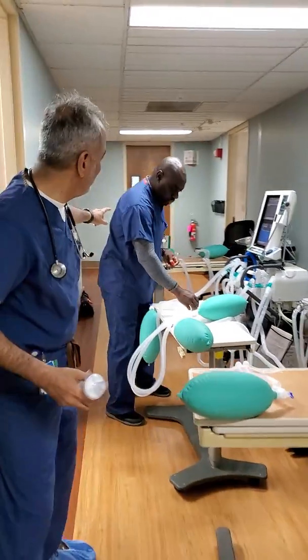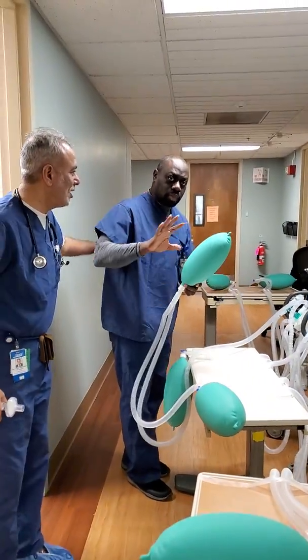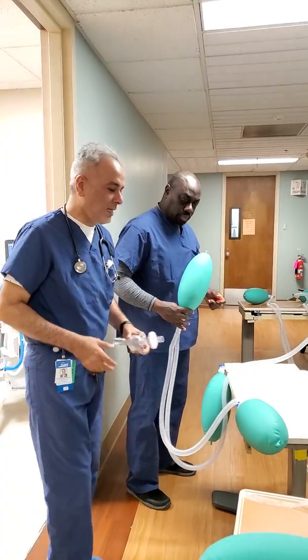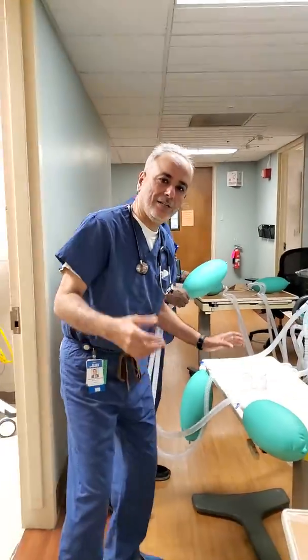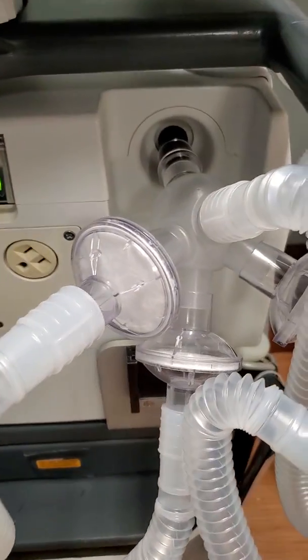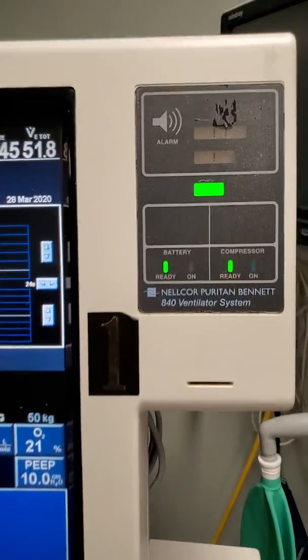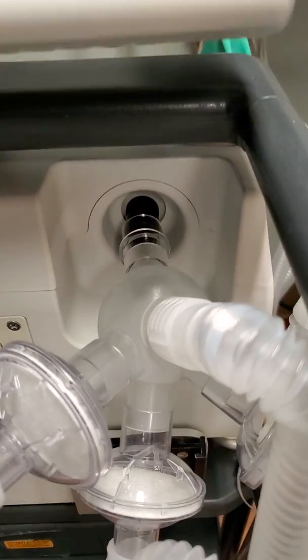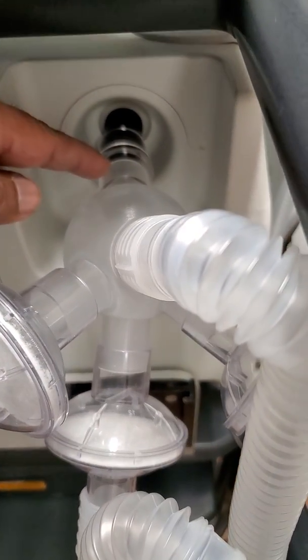Here we have Marvin. Marvin is a respiratory therapist, my star. You've seen him before do the good work. And what we have been able to do is a few things. I'll take this over here and I'll show you some of the things. So this is the inhalation part of the ventilator, and the ventilators we are using are the Puritan Bennett 840 ventilator system. And we have that same thing connected on the inhalation part.